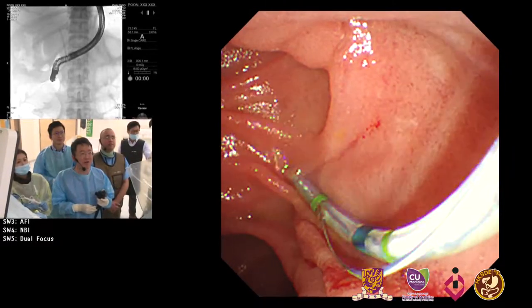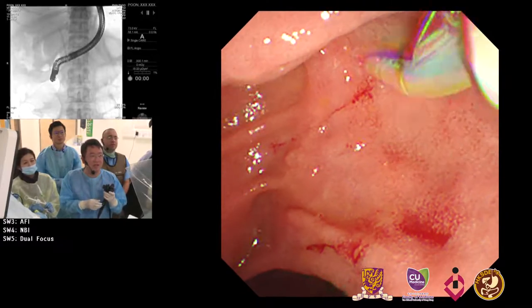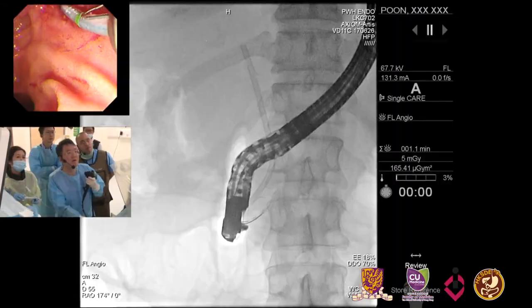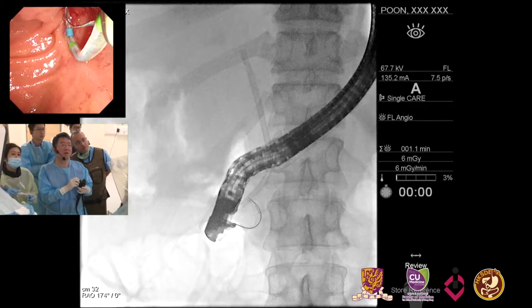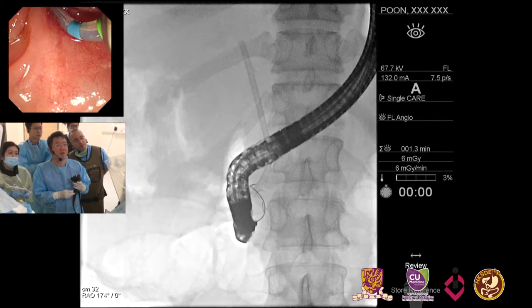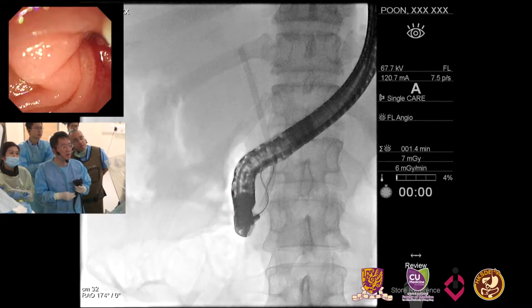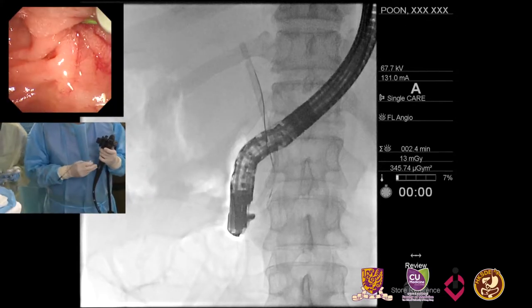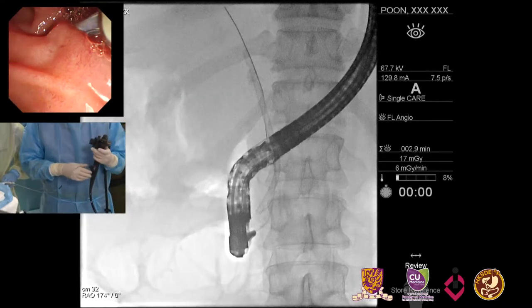So now, although the axis is poor, I will start to cannulate, tracing the hint of here, like this. I think the papilla is here, somewhere here. Just open. Got one. Push. Loose the knife. Okay. So is that how you would do it, YT? When you encounter difficult cannulation, what was your approach? It's fast. It's good. Okay, let's go up. Very tight. Okay, let me cut in.